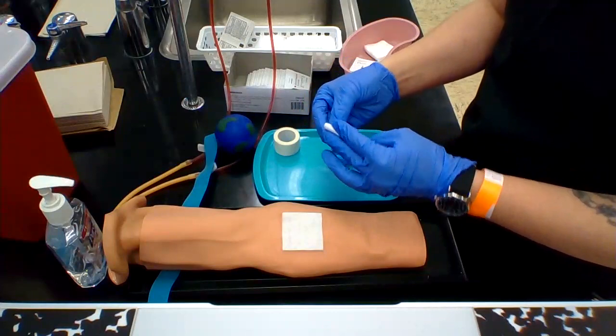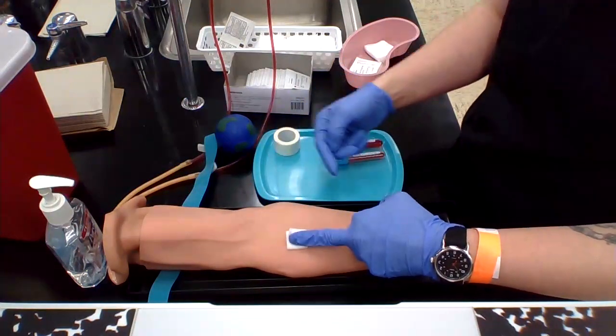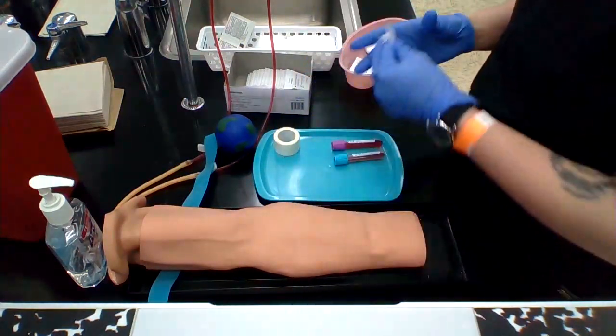Fold your gauze. Take it and bend the arm up. Make sure to pick things up. You're good. Thank you so much.